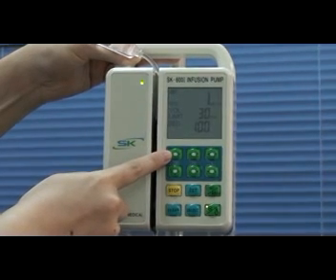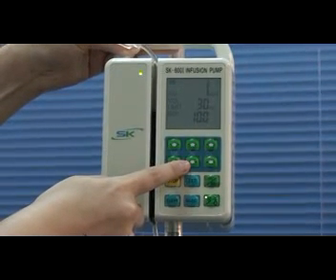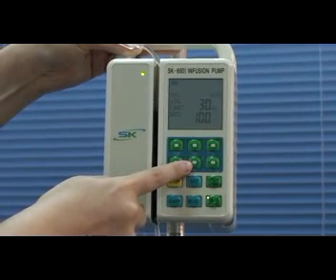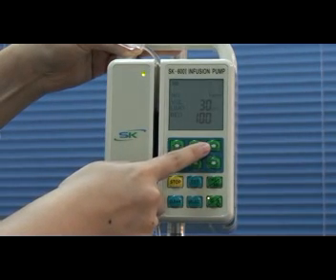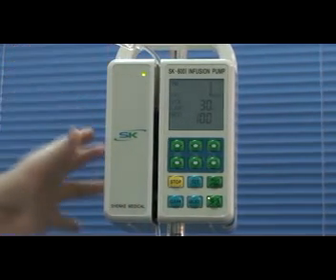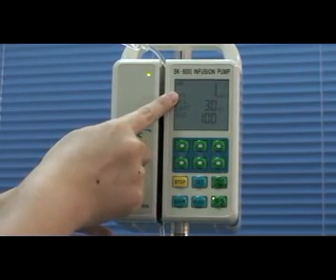If you press up 100 key, the value will increase by 100. If you press down 10 key, the number will decrease by 10. If you press up 1 key, the value will increase by 1. Now we change the flow rate into 250.